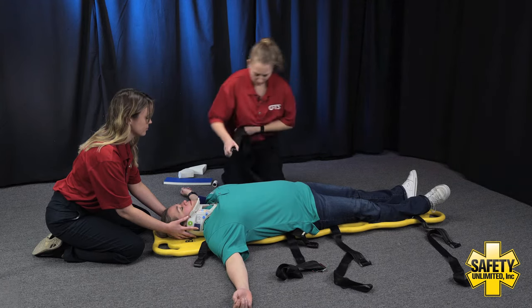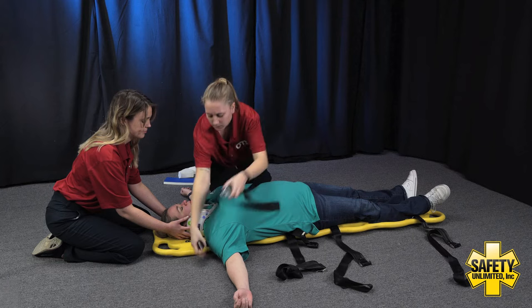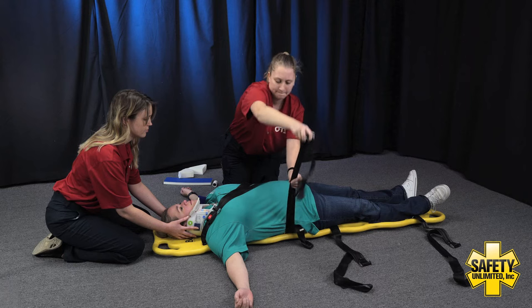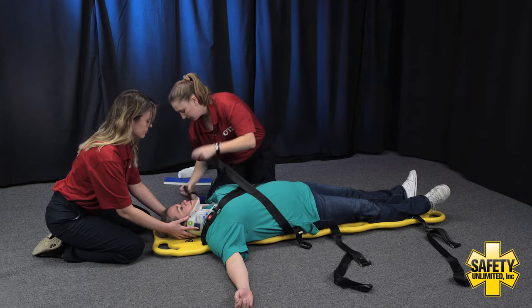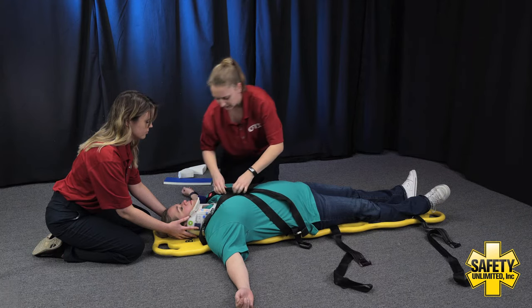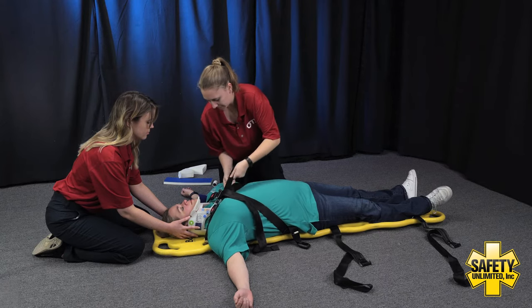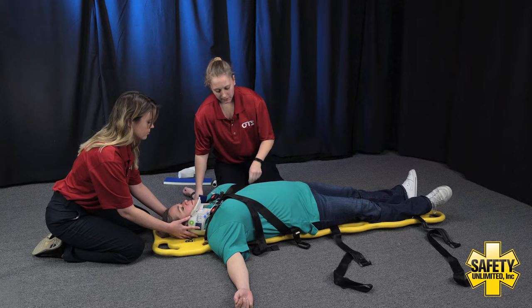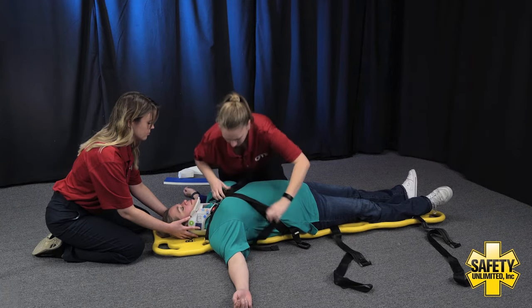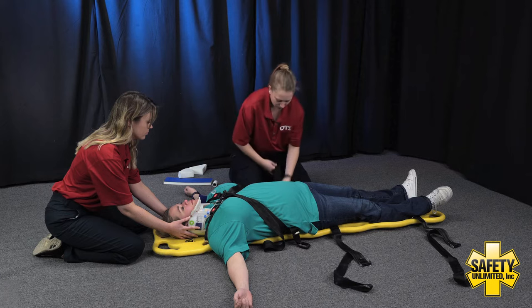We have two X straps going across the patient's chest. I'm going to click them into place and tighten them once I get the other strap ready. Patient, can you go ahead and take a deep breath in for me? Go ahead and breathe out. I'm going to have you take one more deep breath. Go ahead and breathe out for me. How are those straps? Still able to breathe okay? Alrighty, we're going to go ahead and move to that waist strap.